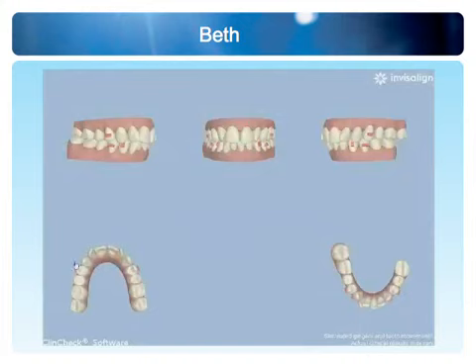So, we take a look at the ClinCheck page, and it will show us different views. But I like to focus in on the maxillary arch, because I know I wanted to bump it out a little bit. I know there is IPR in the case because I put it in there. I put it behind the canine. And canine premolar IPR is wonderful for establishing width and for going to expand. I love to put IPR on the posterior teeth. So, for upper laterals like this, I like to see them treated well. I try not to IPR them.